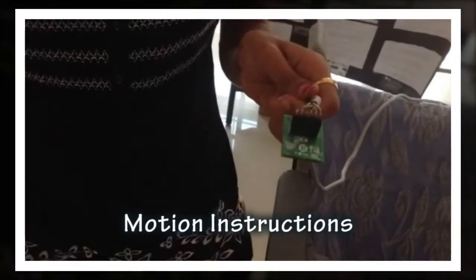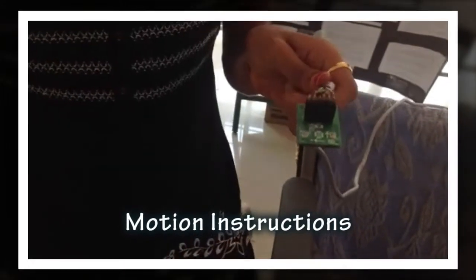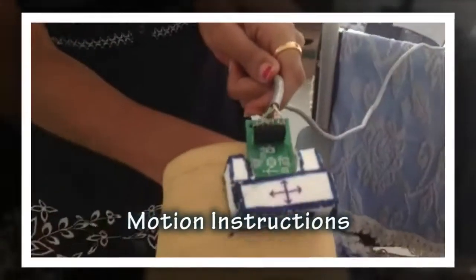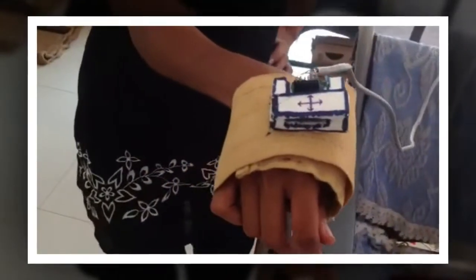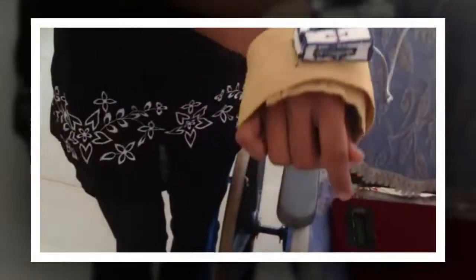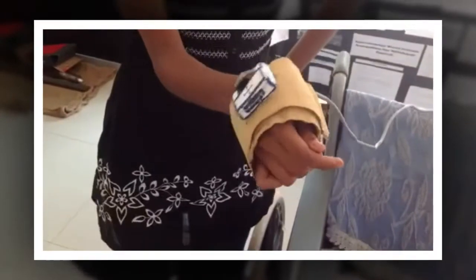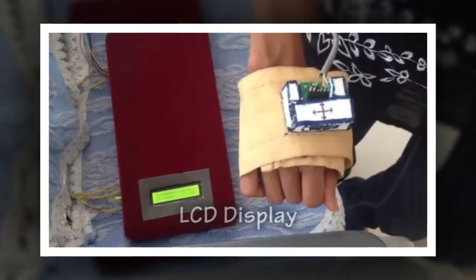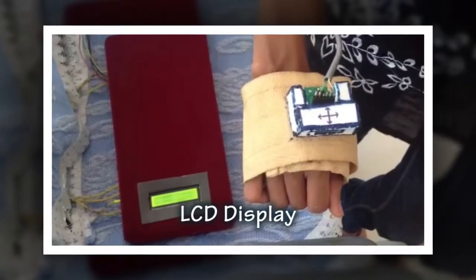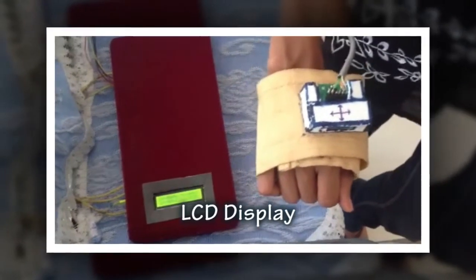The person should wear the accelerometer at the hand. This is the forward motion, this is the backward motion, this is the left and right motion, and various other motions. Now the accelerometer is in the stop position, and stop is displayed on the LCD screen.